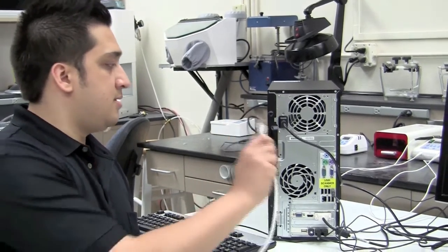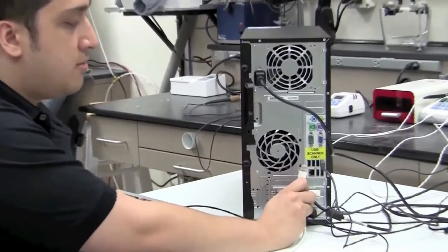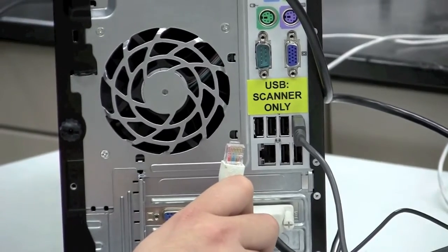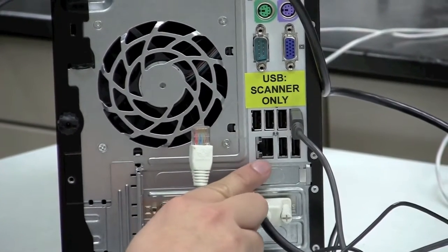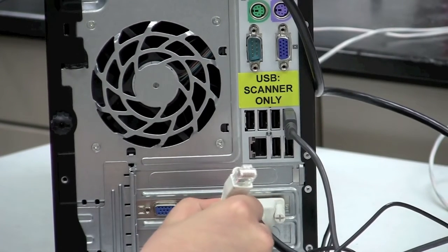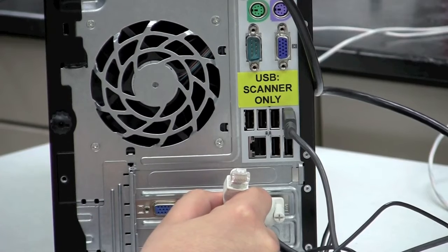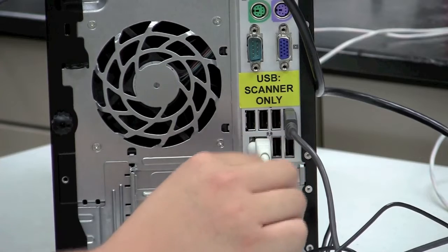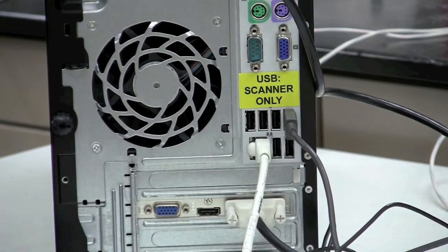A necessary component for working with your 3Shape system is a working internet connection. This needs to be a broadband connection — either cable or DSL internet. You'll need a wired connection from your router, cable modem, or DSL modem going directly into the back of the computer. This will look like an oversized phone jack, and the cord will be double the size of a regular phone cable. Plug it in one way, you should hear it snap, and that cord will be securely in place.